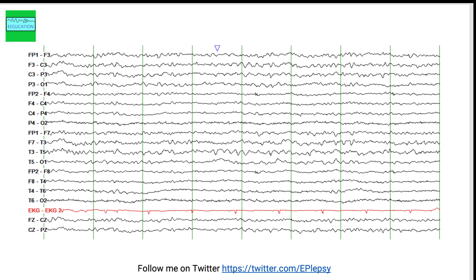Whether it is the left side or the right side that is abnormal may be hard to determine without a clear clinical history. If someone has a structural abnormality on the right hemisphere, you expect lower amplitudes on that side. Likewise, if someone just had a seizure from the left side, you can see postictal slowing on the left. Look through the whole EEG for asymmetries, reactivity — whether better seen on the left or right hemisphere — and look for epileptiform or sharp wave discharges.